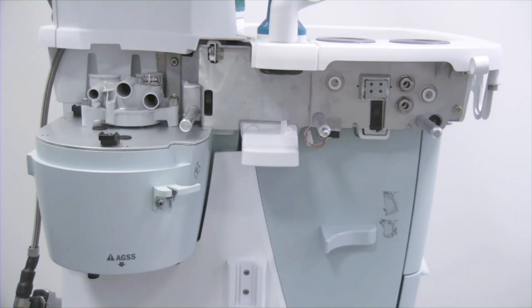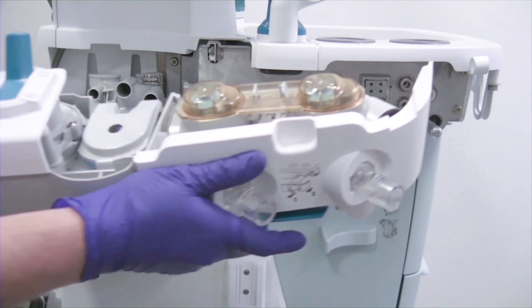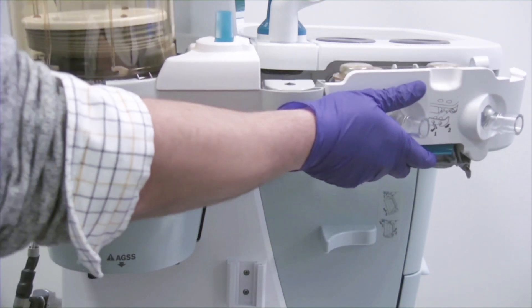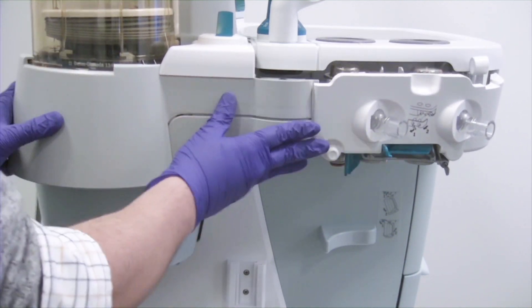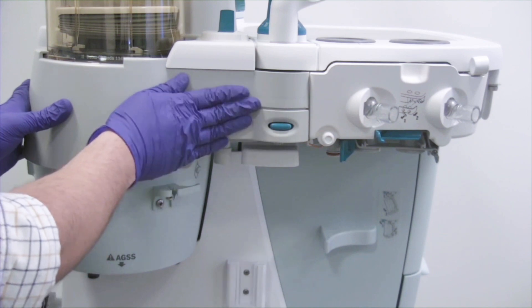To install the breathing system, first identify the guide pins on the anesthesia delivery system and align the guide pins with the guide pin openings on the breathing system. By holding the rear handle and the latch handle, slide the breathing system onto the guide pins. Press in firmly until it latches.